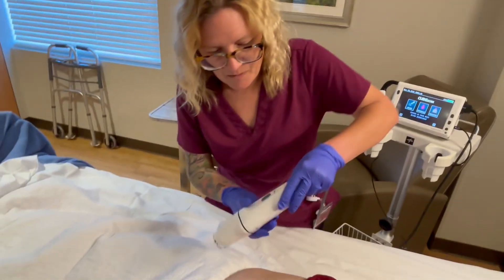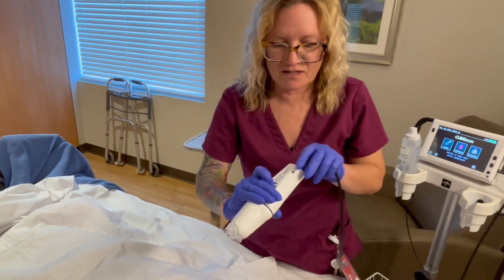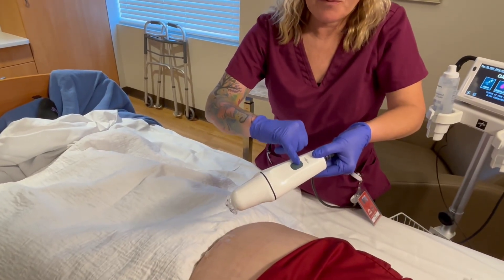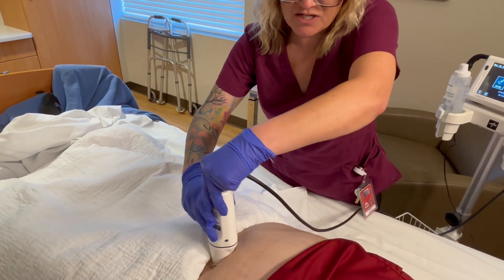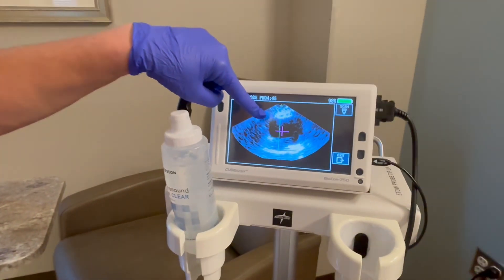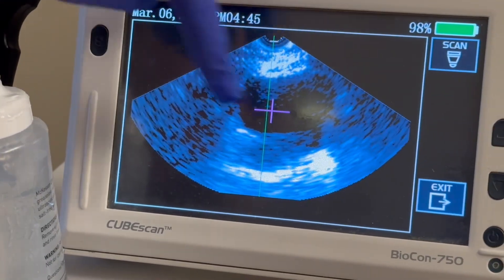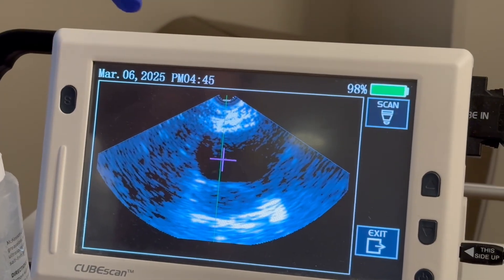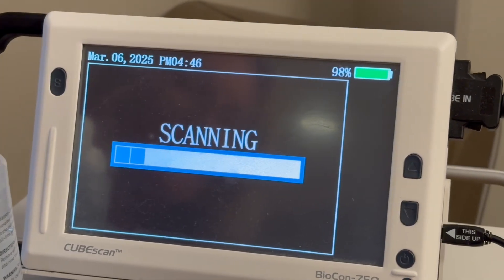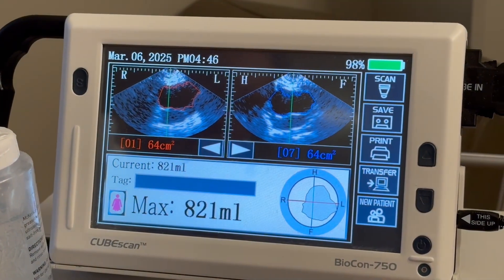When I place it down, I want to make sure that the head portion is facing the head — which would be this way, but you just can't see a picture of it. There's a button here and I'm gonna press scan as soon as I get it on the patient. That's gonna bring up this screen and show me a purple cross and a green line. The purple cross marks the bladder — that's the black circle — so she obviously has some urine in there. Once it gets close to it, it just keeps taking pictures, and then I hit scan and it takes a lot of pictures while it does that.